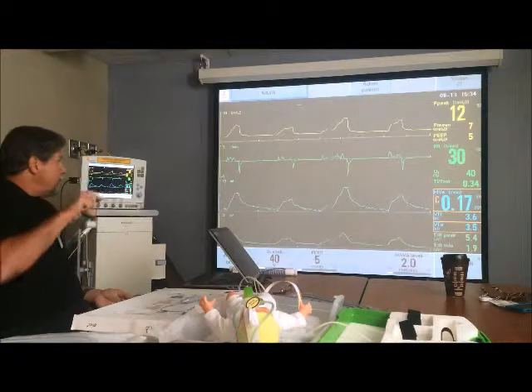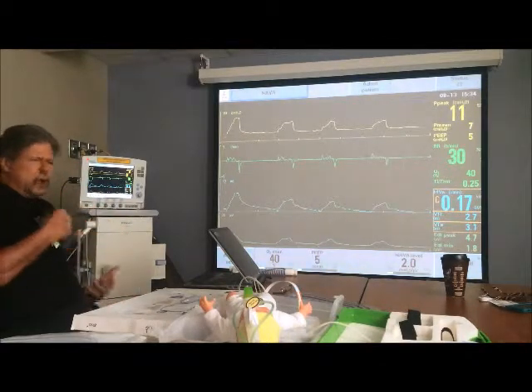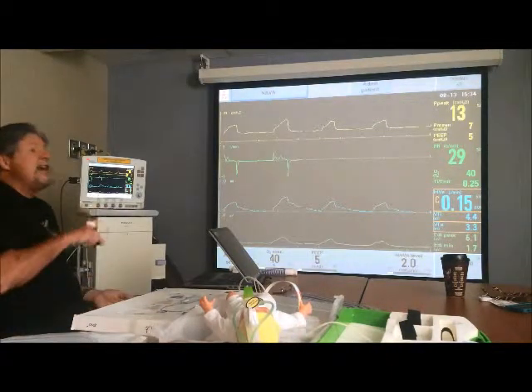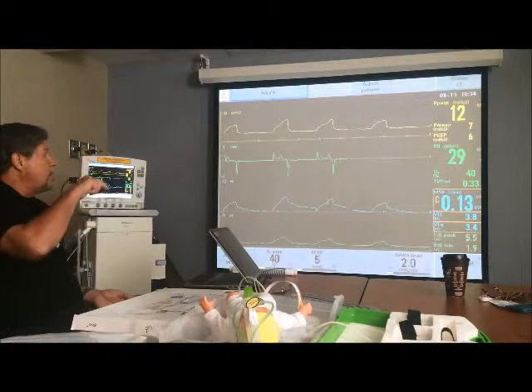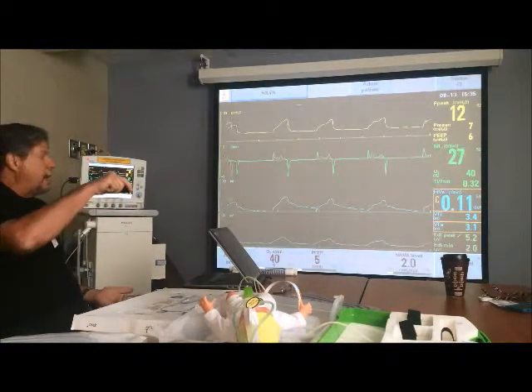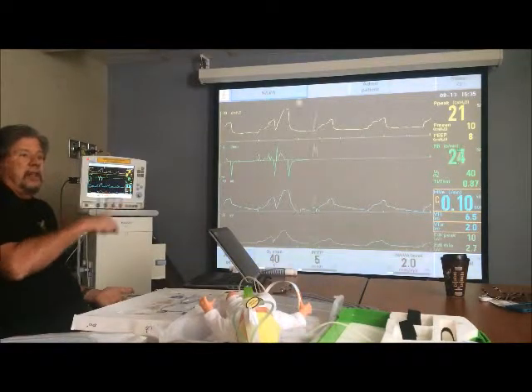So if somebody were to say, what is NAVA the most like in terms of modes that I understand, say it's just like pressure support. But it's variable pressure support. And the variability comes from how the brain wants any particular breath by raising and lowering this number against what our fixed NAVA level is.